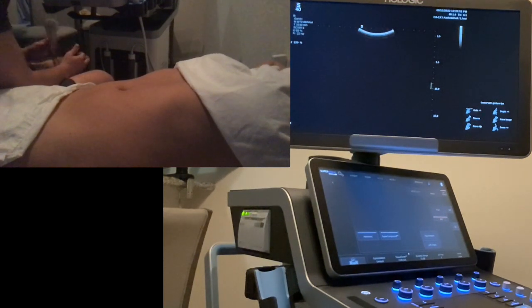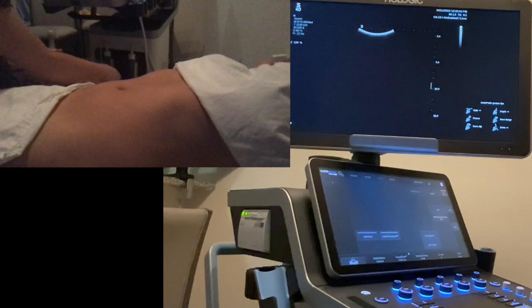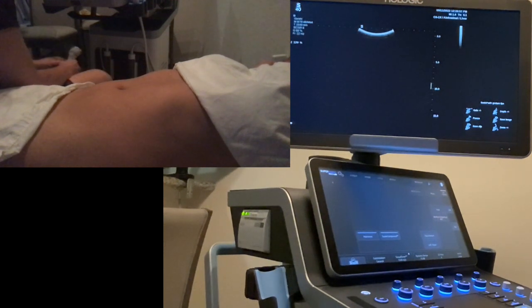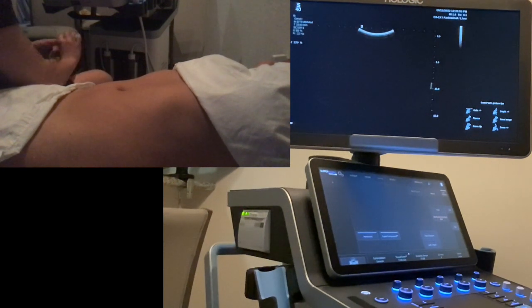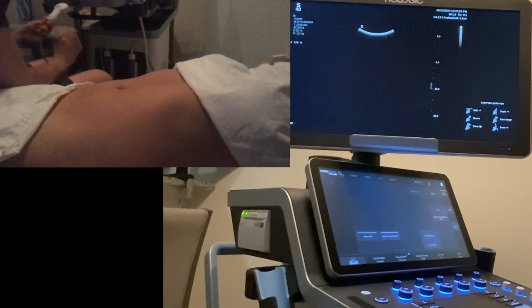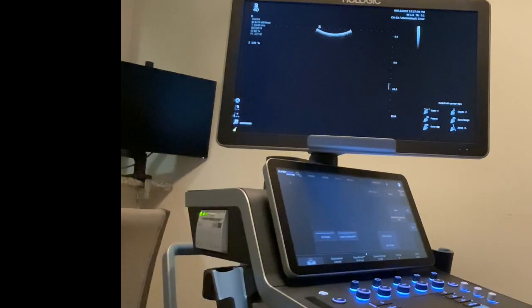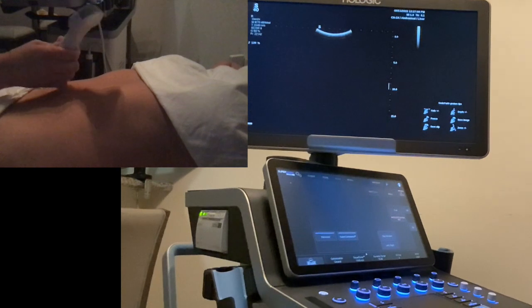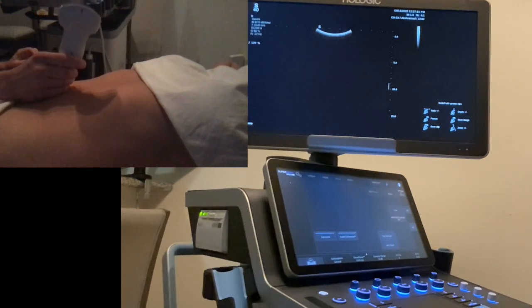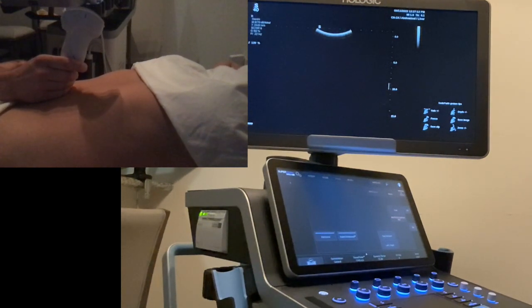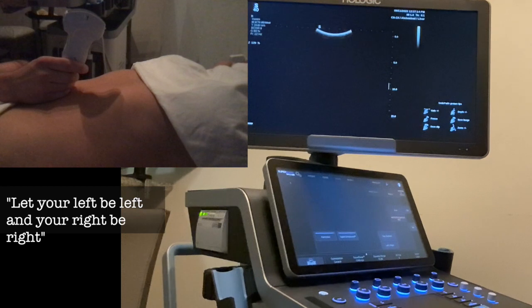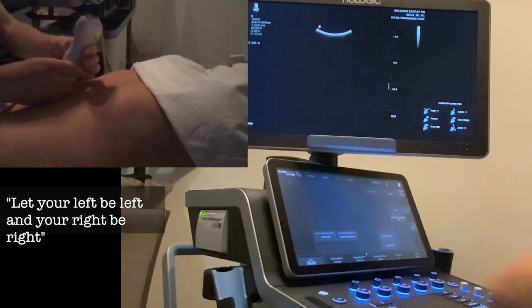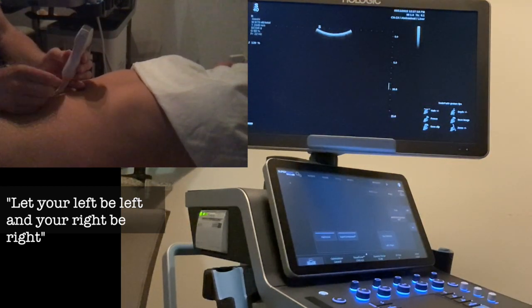I'm using the Hologic Supersonic Mach 30 system with a curved 1 to 6 megahertz transducer. Each transducer has an indicator, and the indicator represents the left-hand side of the screen.